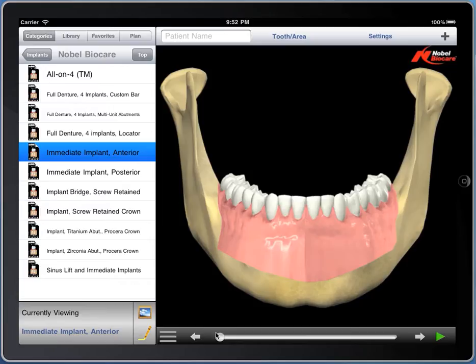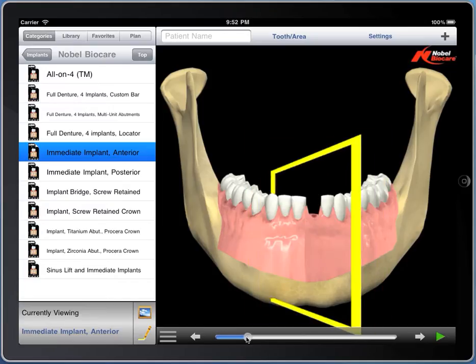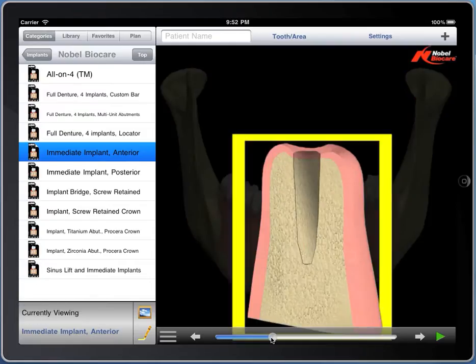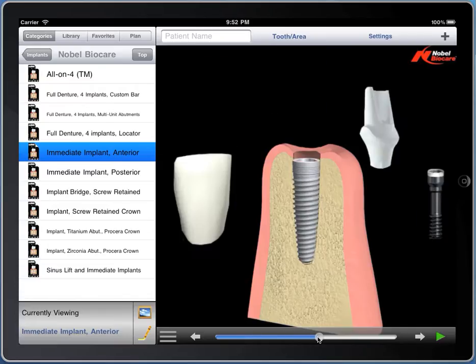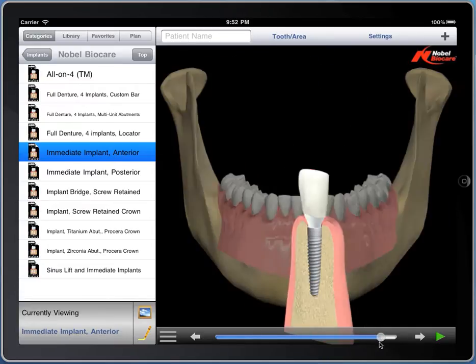Here's an immediate implant in the anterior. This is meant to show somebody how losing an anterior tooth in cross-section will result in an opening. The implant is chosen from the armamentarium supplied by Nobel, placed in the area, and this shows a zirconia abutment and crown.